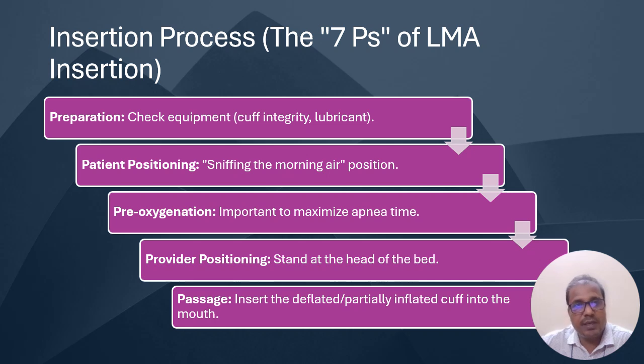And in case of equipment preparation, we will check the cuff integrity, and we will use lubricant to ease insertion of the LMA. And patient positioning is very important, because if proper positioning is not possible, proper insertion of the LMA is not possible.